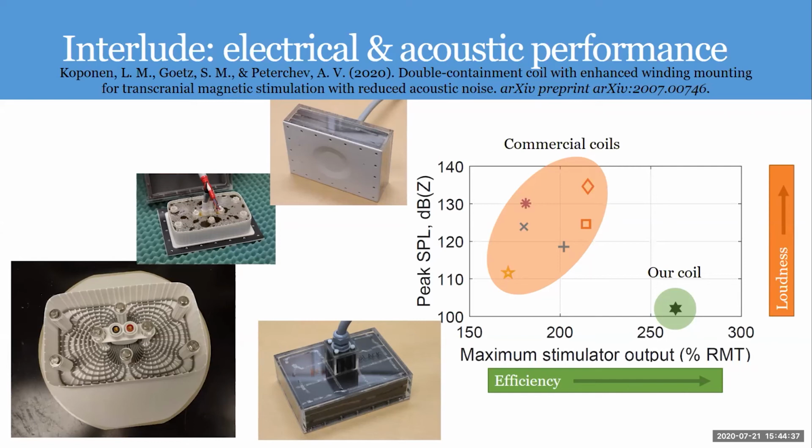So you could, in principle, cool it also from the top of that, or you would have to mill grooves into this to put there either forced air to flow heat away, or even just water cooling, because the heat will transfer into the back plate of the epoxy corundum mixture, which actually is very good at transferring heat. So it heat sinks that heating.